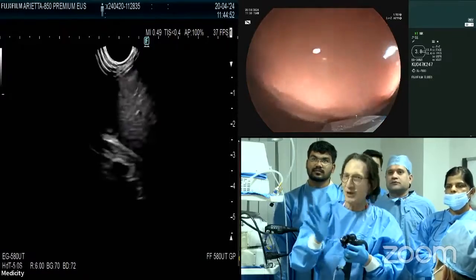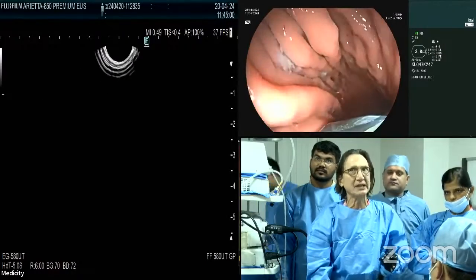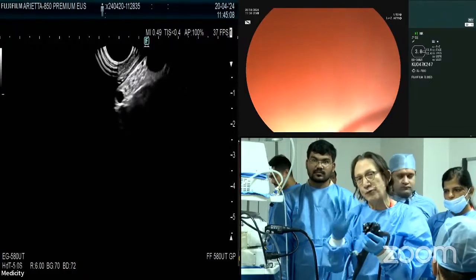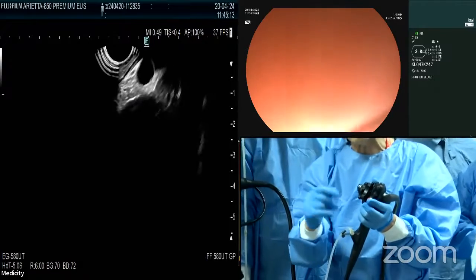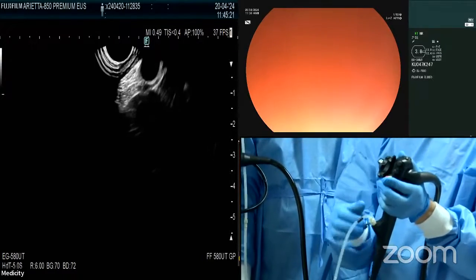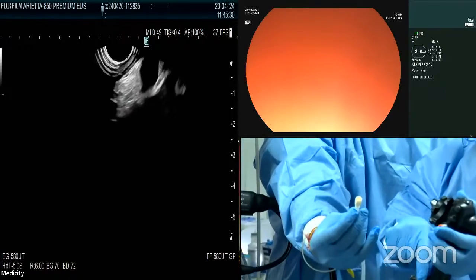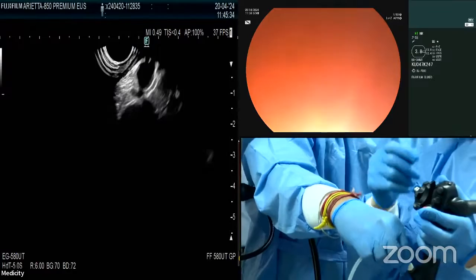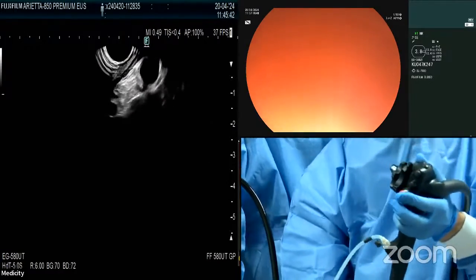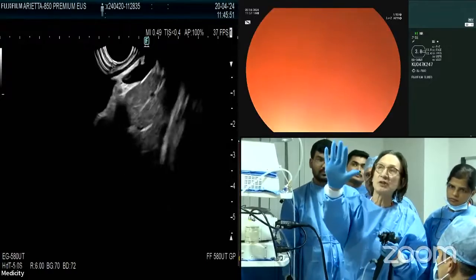Now we need to suck out the gas, because air or gas is our enemy with ultrasound. We orient the tip of the scope towards the fundus, which is to the left. I have a water pump attached to the biopsy channel. The echo endoscope doesn't have a water jet channel, so you need to attach something that allows you to preserve your biopsy port and still irrigate — such as the BioShield from US Endoscopy. Let's now fill the fundus with water — water is our friend. Now switch to the ultrasound view.